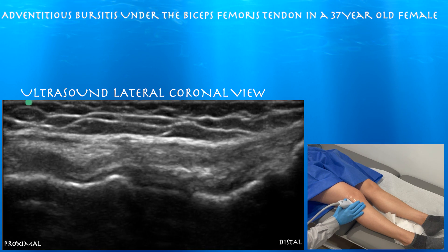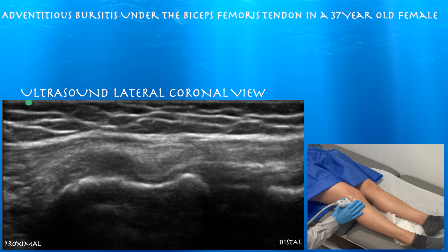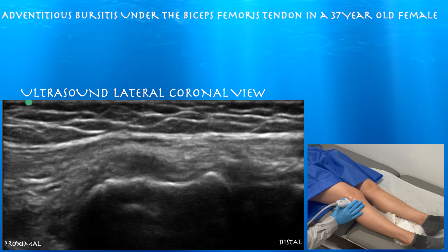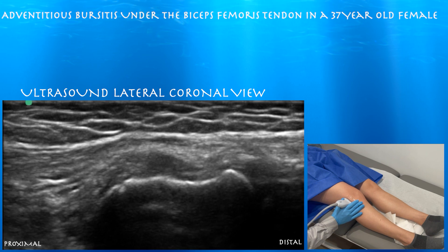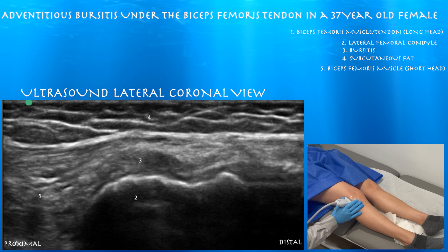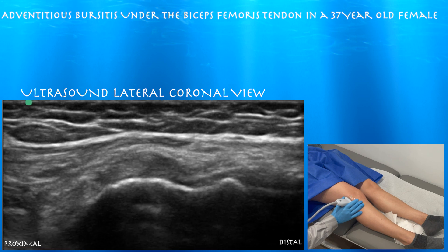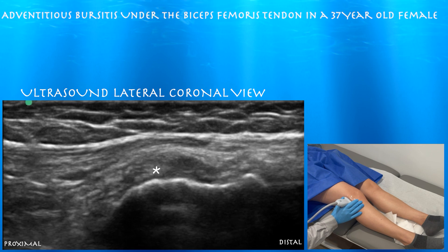Here you can see a hypoechoic signal with some mixed echogenicity, and this is where she's tender. I believe this is an adventitious bursitis under the biceps femoris tendon slash muscle junction. I'm not aware of a bursa that would normally live in this location, and that's why I'm calling this an adventitious bursitis.